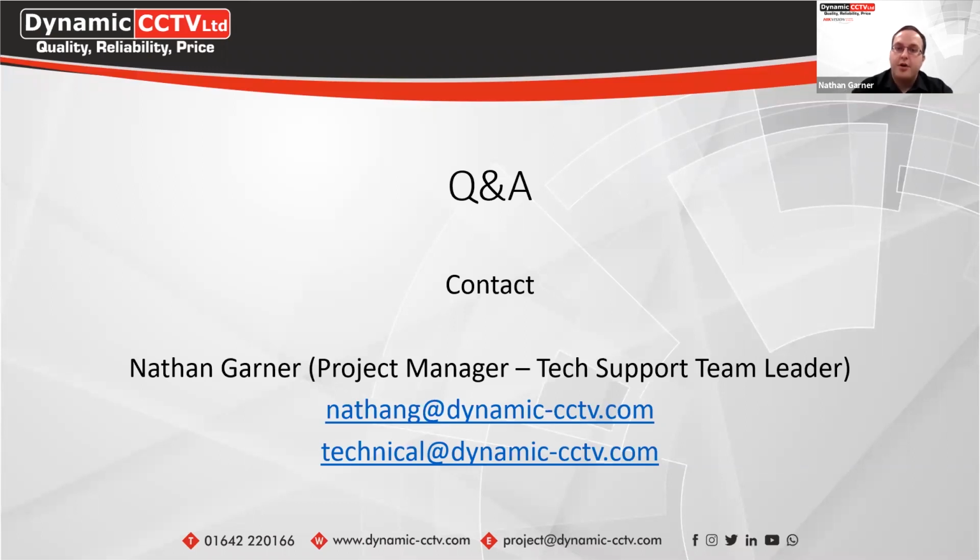Thank you for joining me today and taking the time to join our webinar for this solution. I'll just answer one more Q&A that's just come through from Stuart. At the moment, there aren't any temperature screening cameras that are available for external use. They are for internal use only, because of the environmental factors when cameras are used externally.